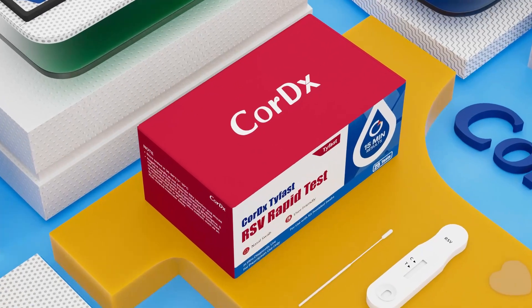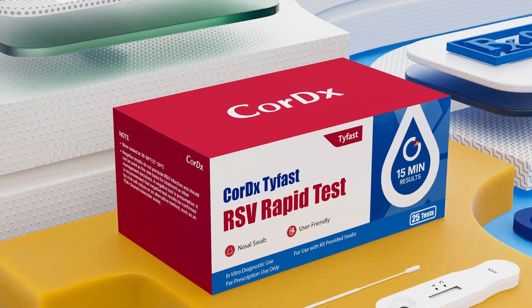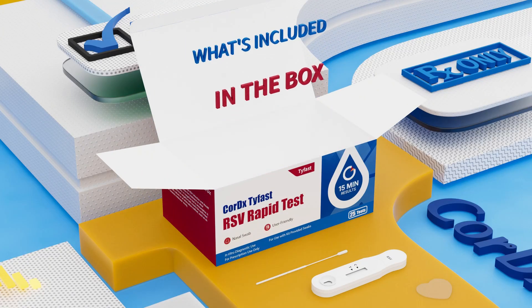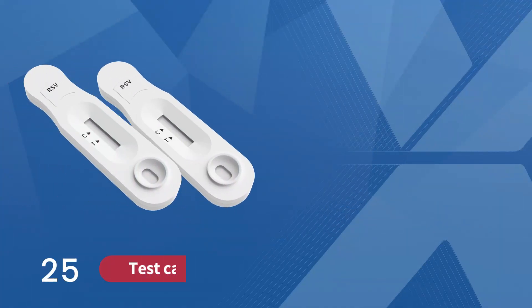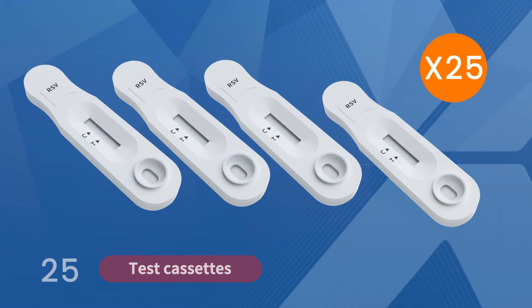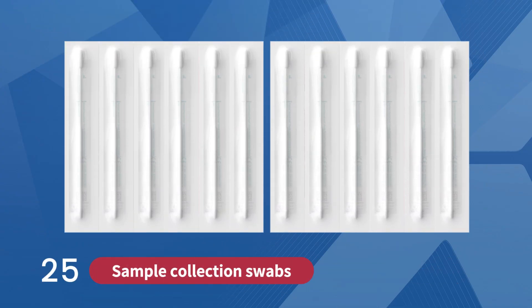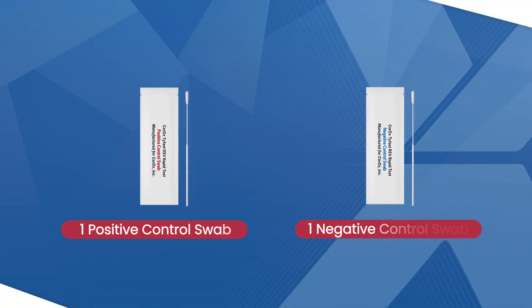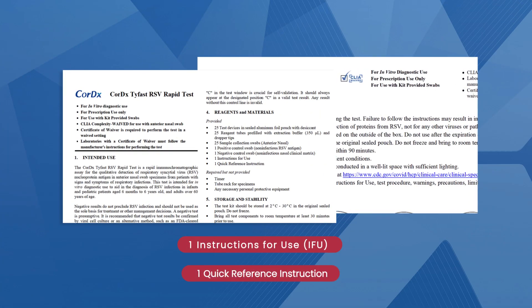Get fast and accurate results to help doctors quickly identify RSV infections. Each box of CoreDX TyFast RSV Rapid Test contains 25 test kits. Inside each box, you'll find 25 test cassettes, 25 tubes with extraction buffer and dropper tips, 25 sample collection swabs, 1 positive control swab and 1 negative control swab, one instructions for use, and one quick reference instruction.